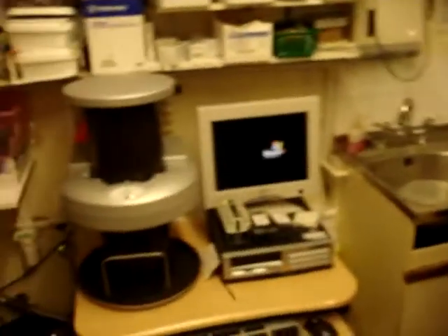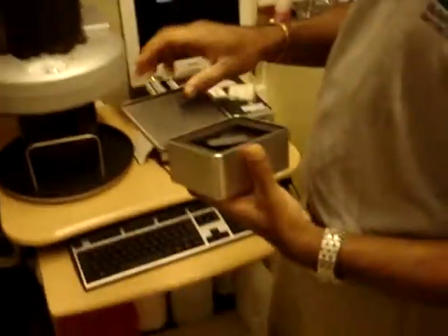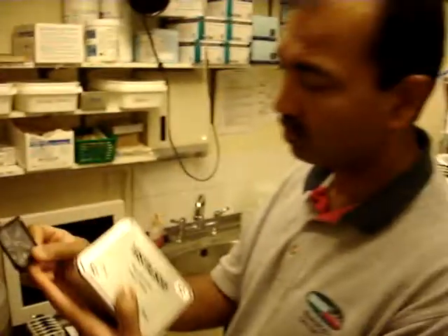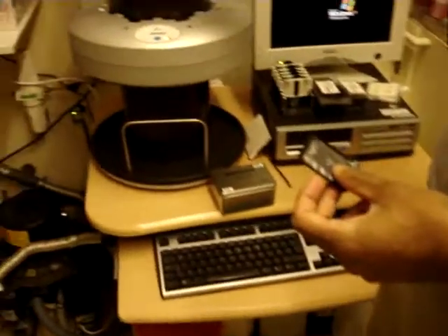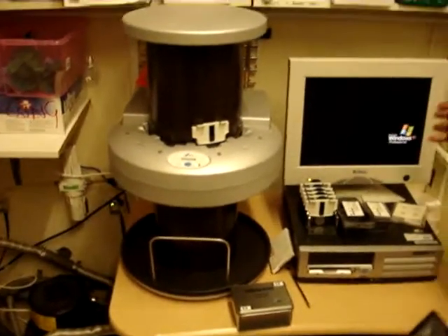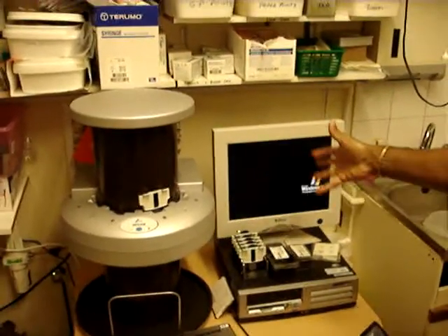When we've got the films from the patient's mouth — which are one of these, it's been exposed — it's a little envelope, so you chuck the envelope away afterwards and reuse the film inside it. The film is taken out, fed into a little holder, and then the holders are put into a machine. We bring the patient's record up as we have in the practice, and we feed the film through. The digital image takes half a minute to come up.